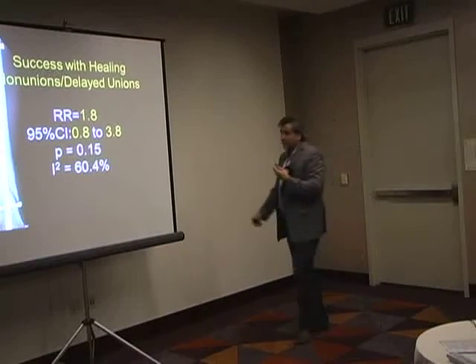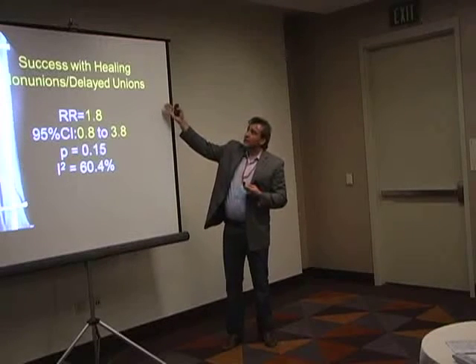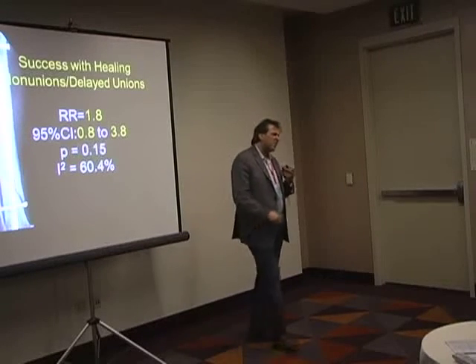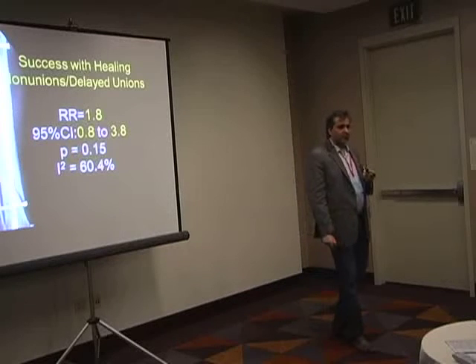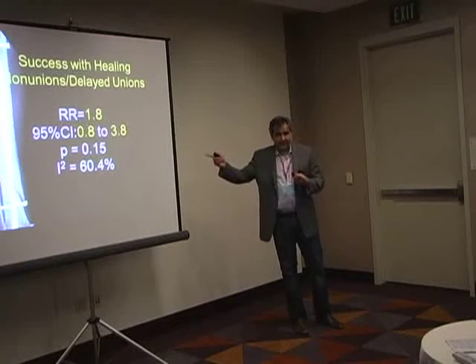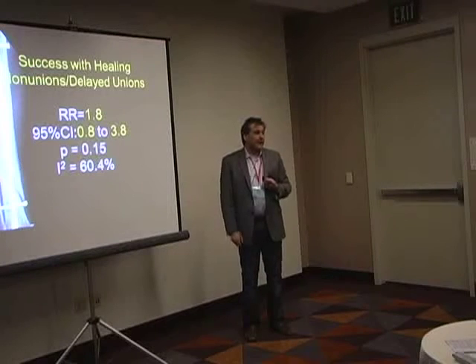And our uncertainty was basically because when we looked at the effect, the likelihood of success in healing nonunions was just under twofold, but it didn't hit statistical significance, which basically meant we need more data. If we believe this is true, we need more data to confirm that. I can tell you in the last 7 years there have been a lot of new trials, and we're currently re-updating this data set. And our re-update of this data set is far more optimistic than that original review was.